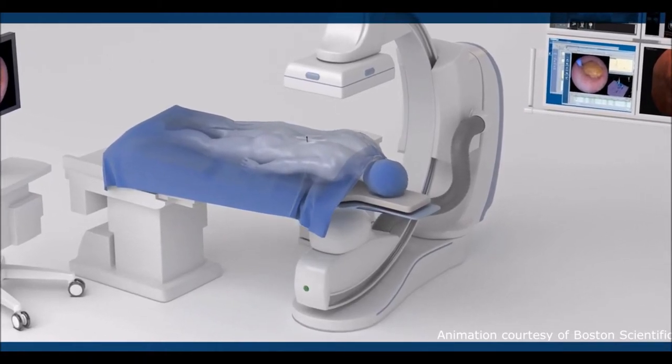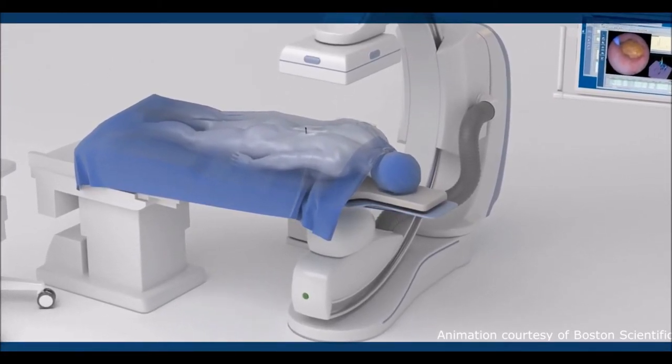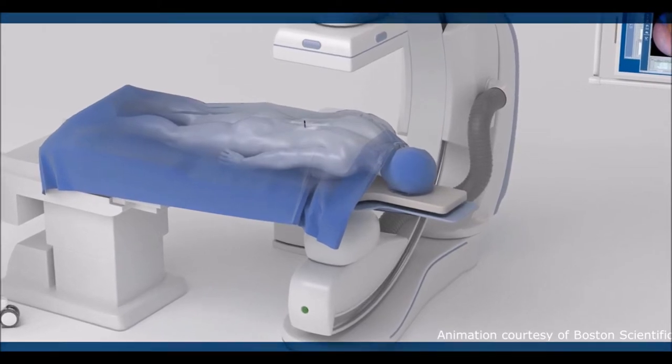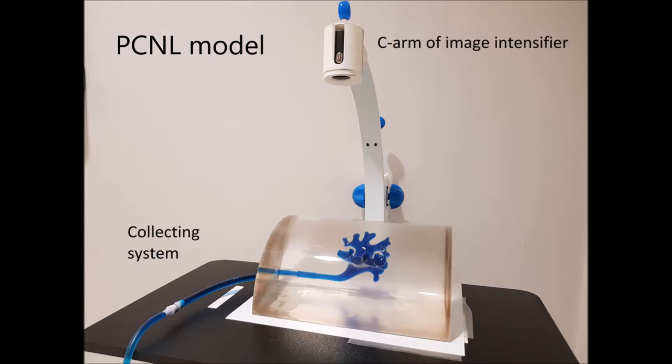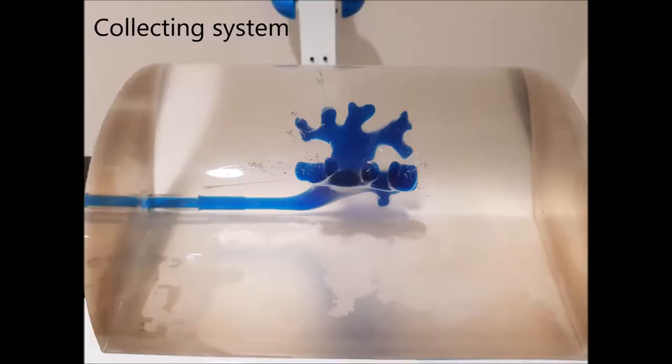In this video, we demonstrate the prone bullseye technique for PCNL puncture. Here is our PCNL model with the C-arm of the image intensifier and the collecting system in blue.